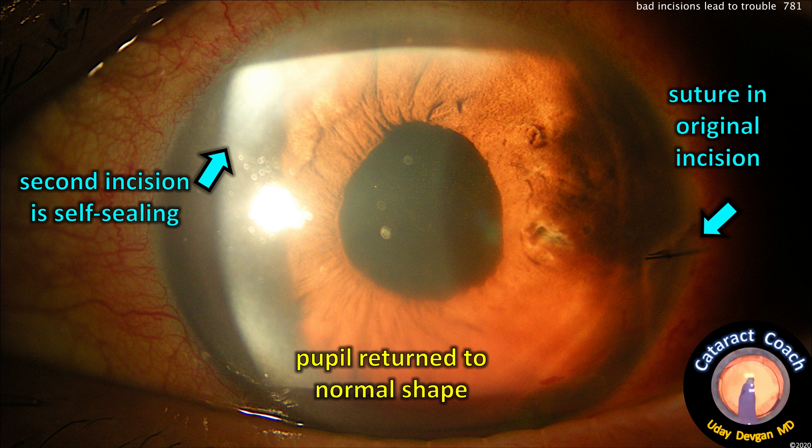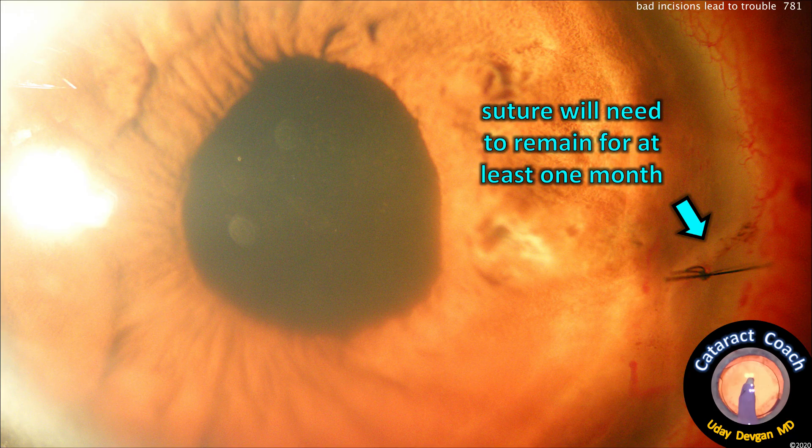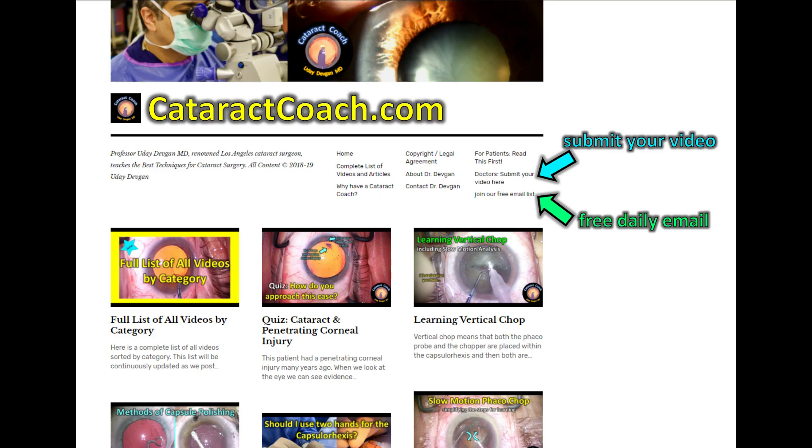Here's post-op day one. You see the sutures in the original incision, and the pupil is back to a normal shape. The second incision ended up being self-sealing. There's a little bit of haze in the anterior chamber because of a little bit of bleeding. That suture will remain for about a month, and the patient will do great — it can be removed after that time. Check out CataractCoach.com, our teaching website. So much great material — you can learn from these cases instead of suffering on your own.